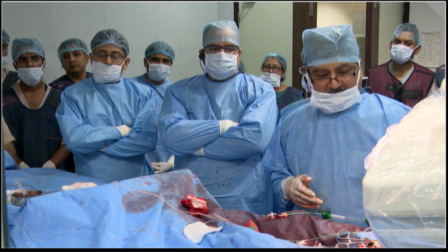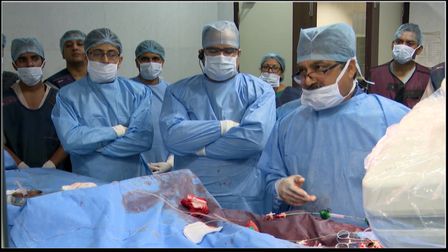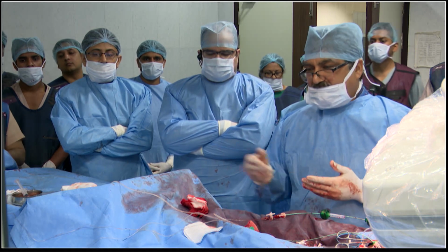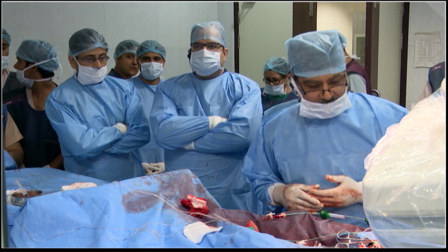Sir, I'll just close the ProGlide from here, and this was a Python sheath, 14 French, through which we have put the valve. Okay, fine. Thank you. Thank you. Thank you.